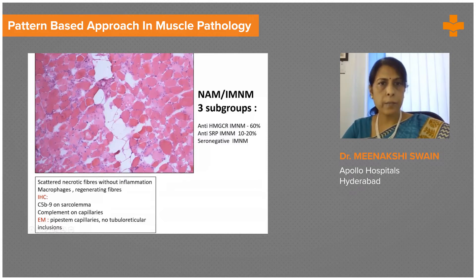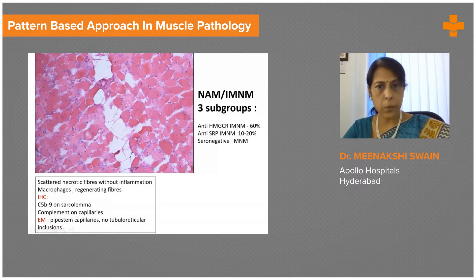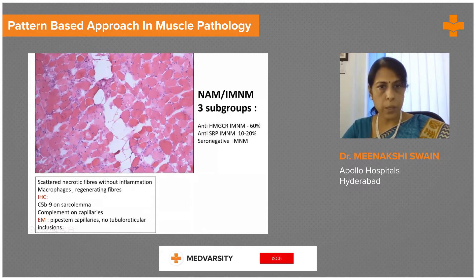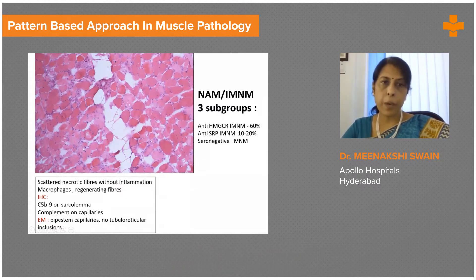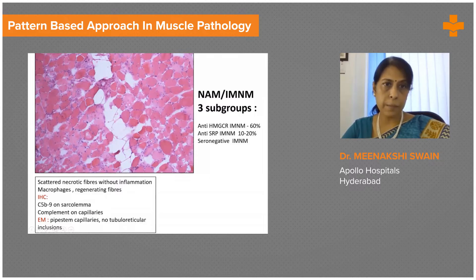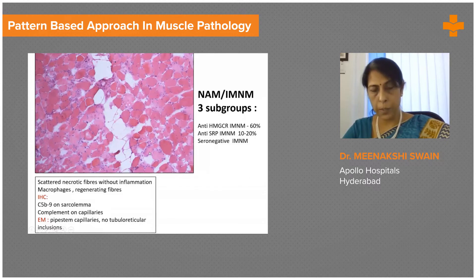This was the example of a 45-year-old lady who presented with rhabdomyolysis, and this is the muscle biopsy. You can see normal fibers interspersed with numerous pale necrotic fibers — myonecrosis which is almost diffuse. There is no inflammation despite so much necrosis; one would have expected the body to respond with inflammation, but there's none. All you see are foci of regenerated fibers and some myophagocytosis. This is a typical pattern seen in necrotizing autoimmune myopathy.